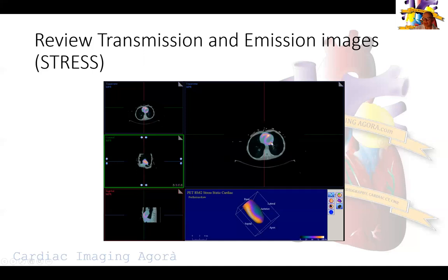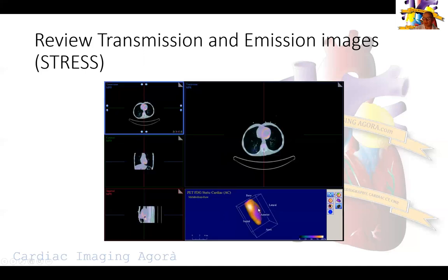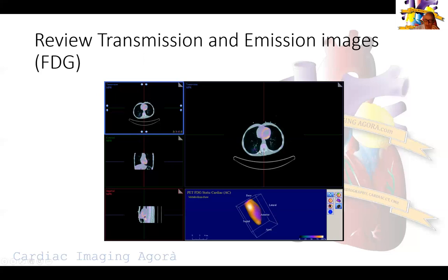These are the stress emission and transmission images — same exercise here making sure everything is aligned so we don't have misregistration. It's very hard not to see this large perfusion defect visible in these reconstructed images. Then we look at the FDG images — we have three sets: rest images, stress images, and FDG images. Each set has emission and transmission images and all of them must be aligned.